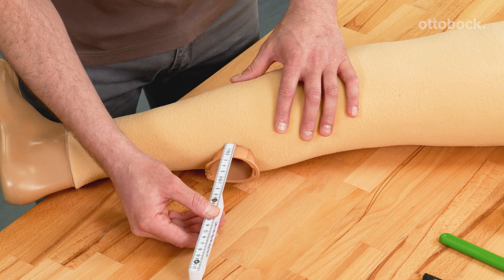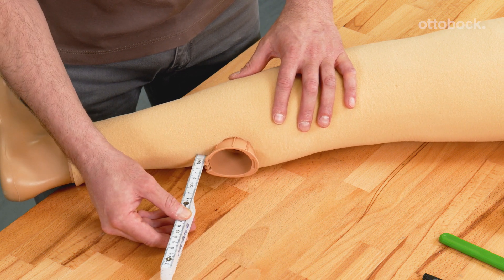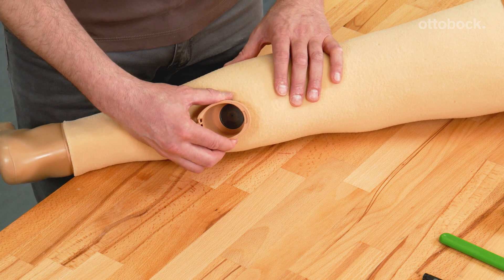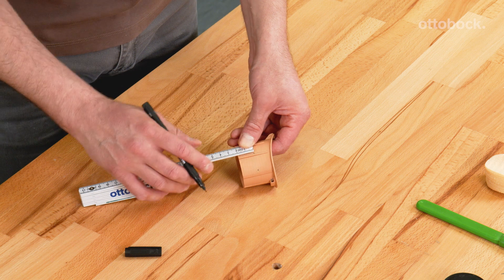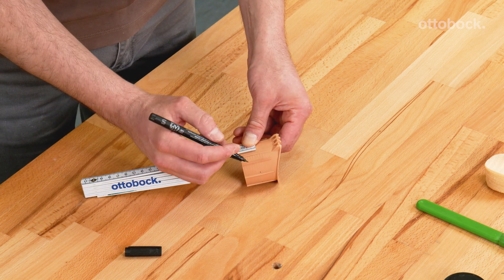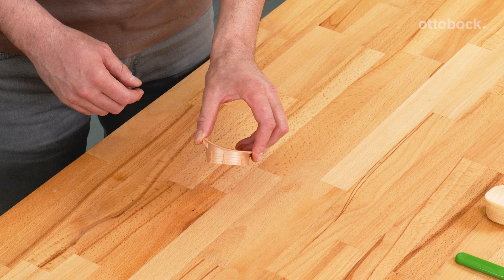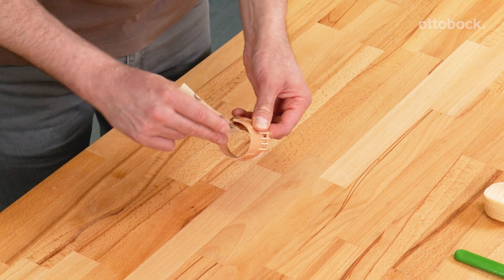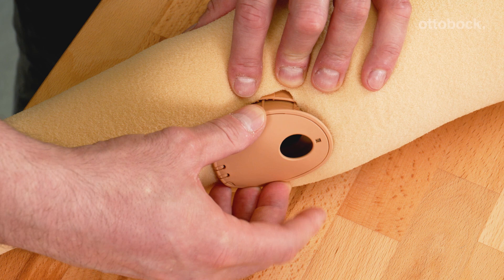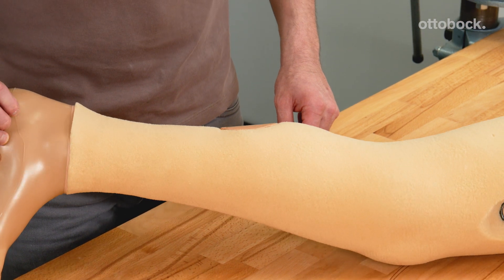Measure the protruding material of the charging shaft. Remove the charging shaft by turning counter-clockwise. Shorten using a suitable tool according to the measured length. Ensure the cut is perpendicular to the charging shaft — any deviation may affect the interlocking with the receiver. Deburr and smooth the edges using sandpaper. Re-install the charging shaft and assess the fit; it should be flush with the surface of the foam cover.